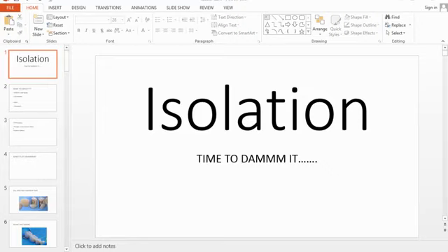So it is the hot topic of the present situation, as we all know why the use of rubber dam is utmost important, as most of the cases in our clinics come for a restoration or a root canal treatment, and we don't want any spillage of saliva in the form of aerosols. So this proper isolation technique will help you to reduce the viral load, as the saliva will be isolated.